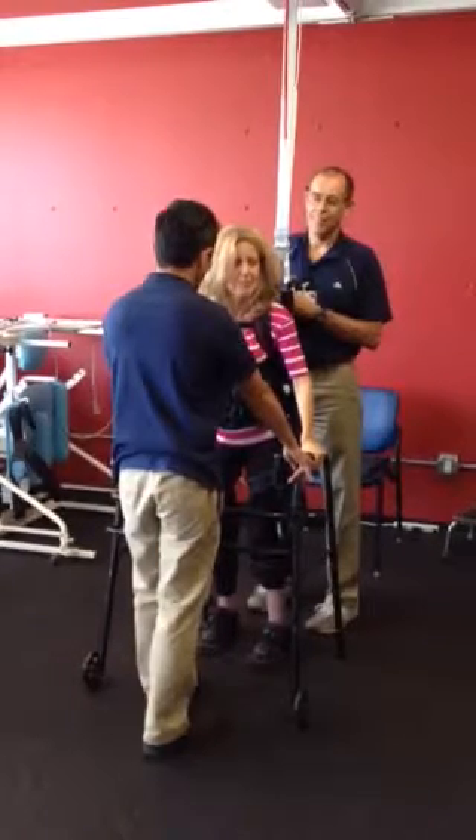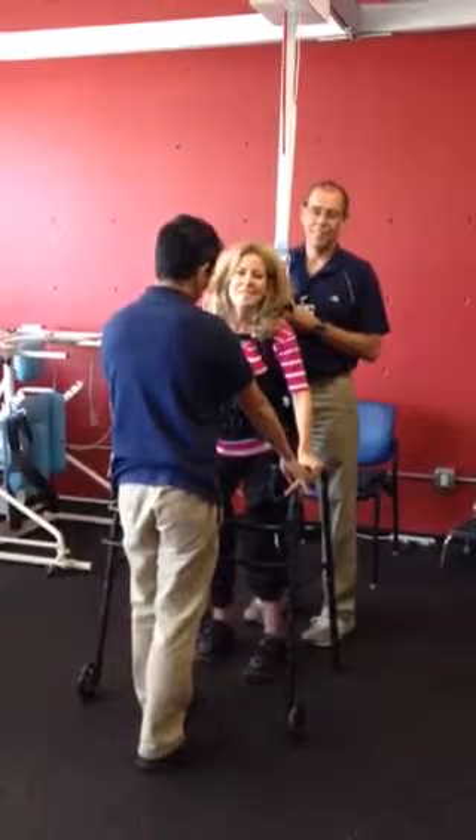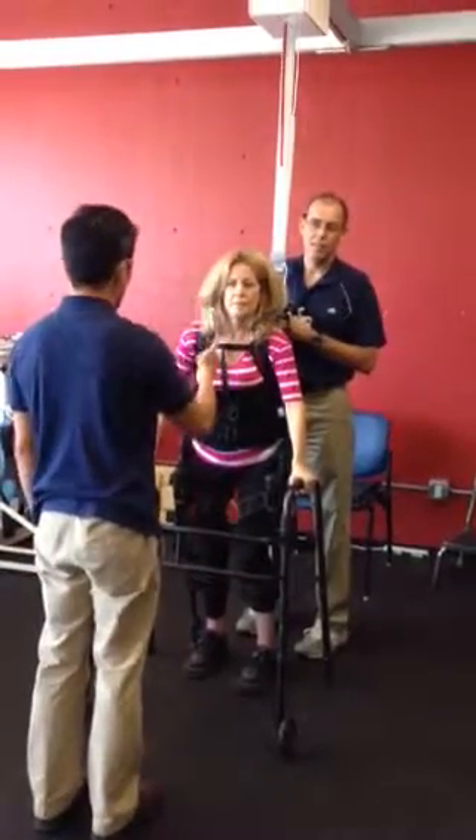You're doing the sweet spot right now. Does it? No — that's it. You're going to sit me down. You're okay. Also, when we stopped like this — you know how we were walking and we stopped? It's a thing called a stand skill. We're going to press that.